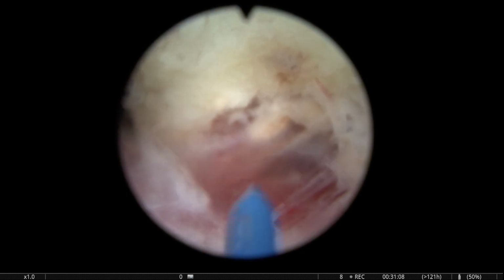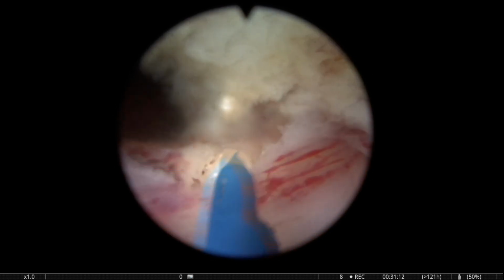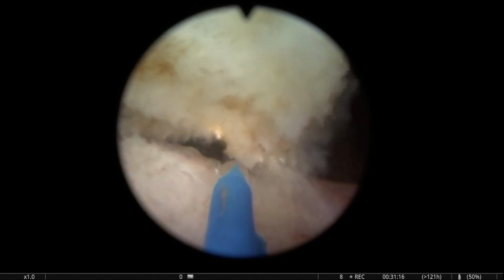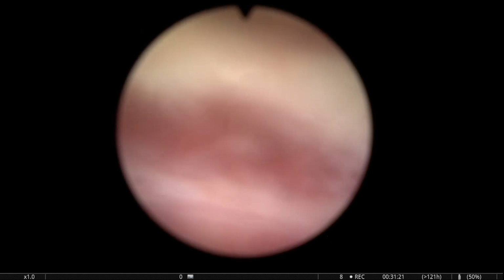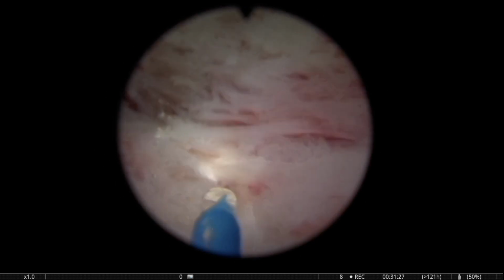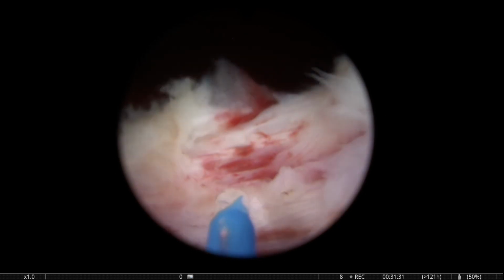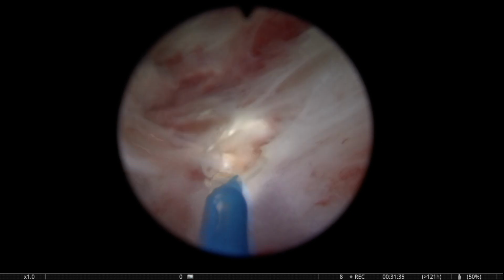Some people do incisions in the bladder neck after removing the adenoma. I think in this case there's already a very good depth, and you see we have managed to get into a very good capsular plane. We are sure that there's no remaining adenoma, and now of course I have to do hemostasis.